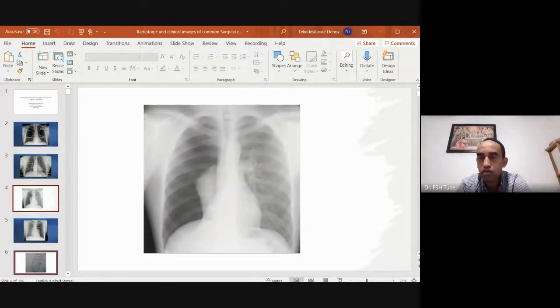Somebody said pneumothorax. Which side? On the right side. Excellent, Saka. So you have to be specific, okay? When somebody asks you what's your diagnosis, you should say right pneumothorax. That's how you should answer. Because is it a left pneumothorax? Is it a tension pneumothorax? Simple pneumothorax? So you have to qualify that.